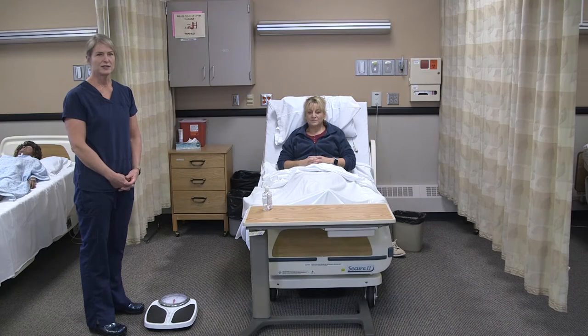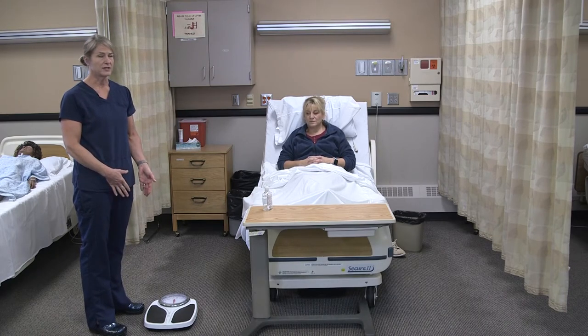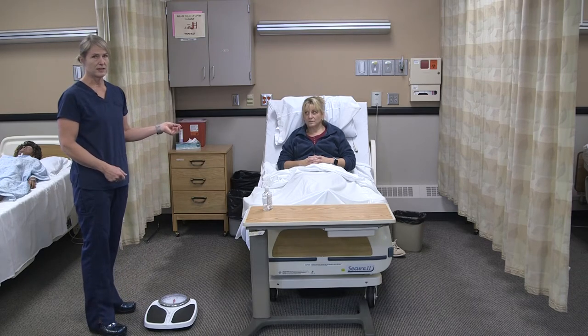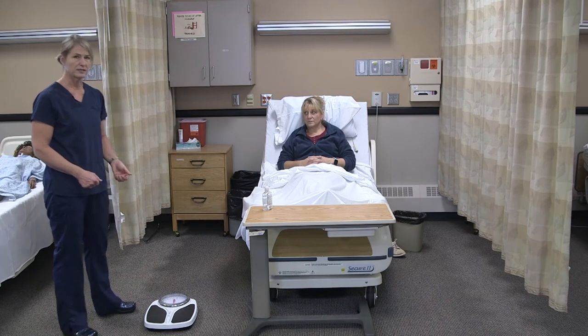To get the weight for a resident, the only supplies we need are a scale. Sometimes the scale is in a common area like a shower or bathroom, and if so, you will have to have the equipment you need to ambulate the person depending on their status. Annie is able to walk by herself with just a standby assist, so I brought the scale to her room.